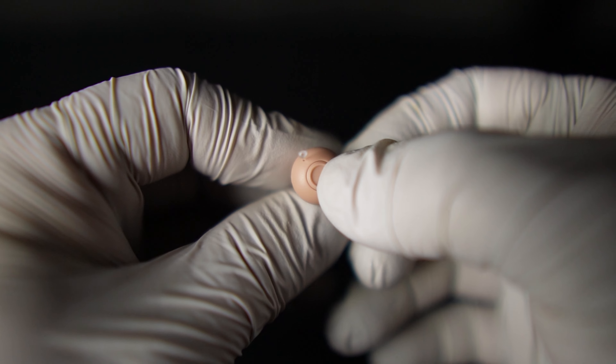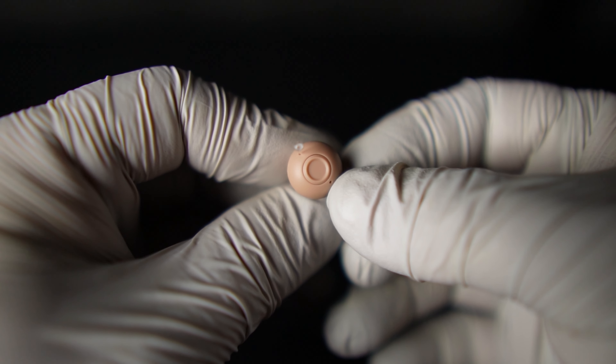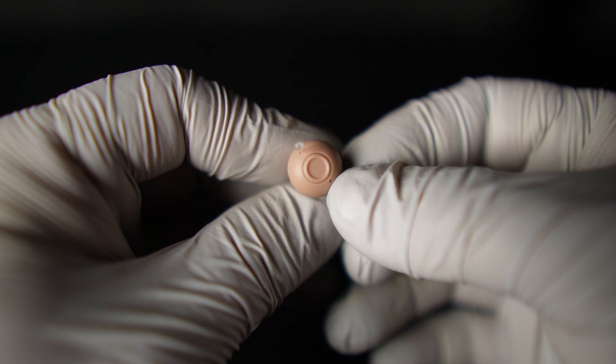To change the volume it's super simple. Each hearing aid has one circular button in the middle. You just quickly press and release — you'll get one beep, two beeps, three beeps, up to five beeps for the highest volume level. Press again at level five and it cycles back to one. Each hearing aid is independent of the other; they do not sync up. On prescription hearing aids, turning up one usually turns up both — these are set individually, which is neither good nor bad, it just is what it is.